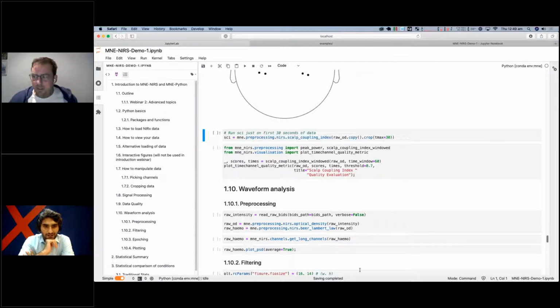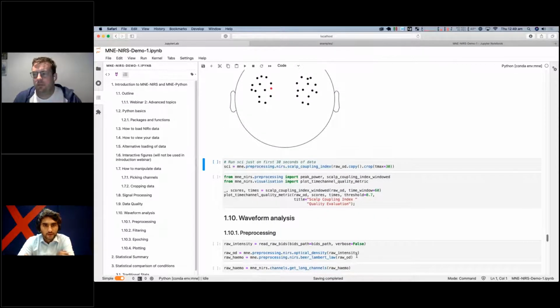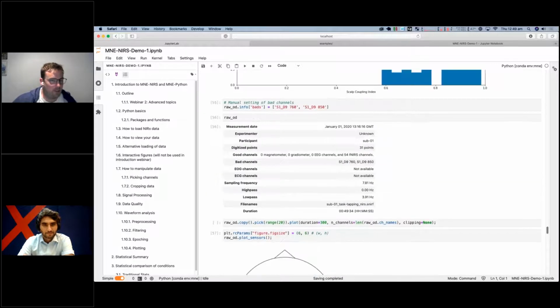Well, we can, yeah. Very quick question. The scalp contact index, scalp coupling index. If you could talk very, very briefly about that, what is taken into account? Okay, if we're not rushing, definitely. Yep, let's go. Let's go up a bit then.